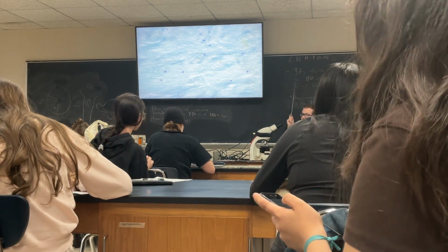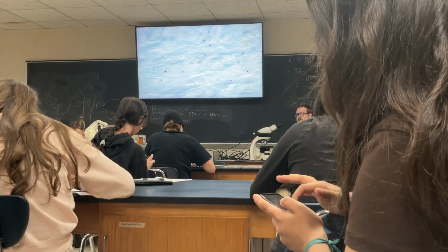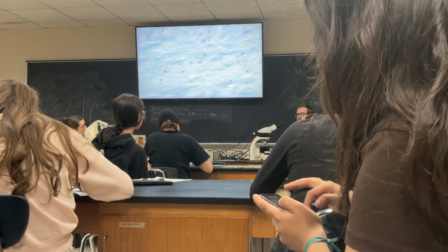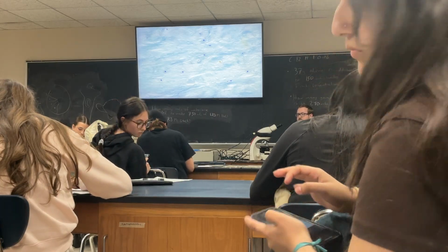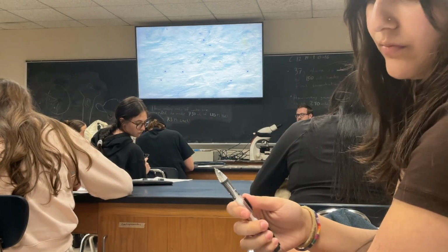So this is fibrocartilage. So we've done all three cartilages, and we've done one of the two connective tissue propers, or one of the three, I guess, in the form of dense regular. We've done one of the three. Repeats or questions while I kind of got it.